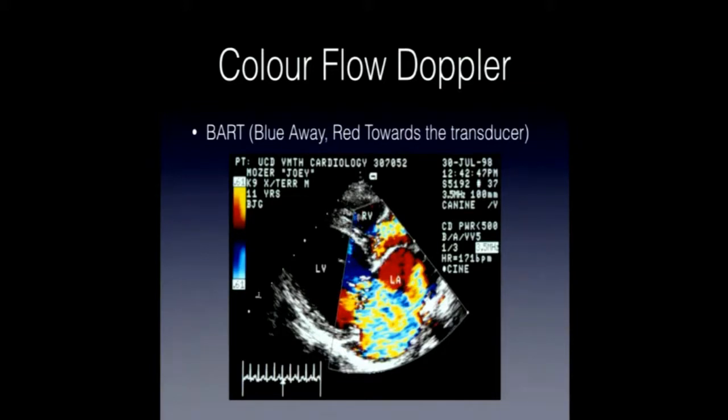We also have to keep in mind our Nyquist limits, which are these numbers here, 0.61. Often it's represented in centimeters per second, so it'll be around 61 centimeters per second instead of 0.61. And this is actually a pretty good rate, in fact. So, yes.